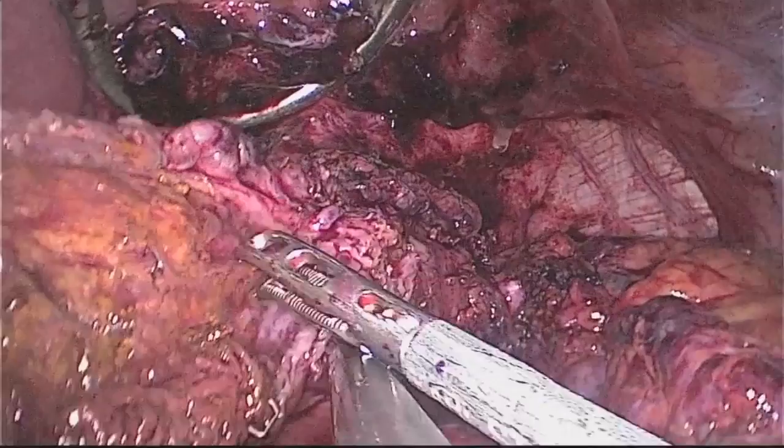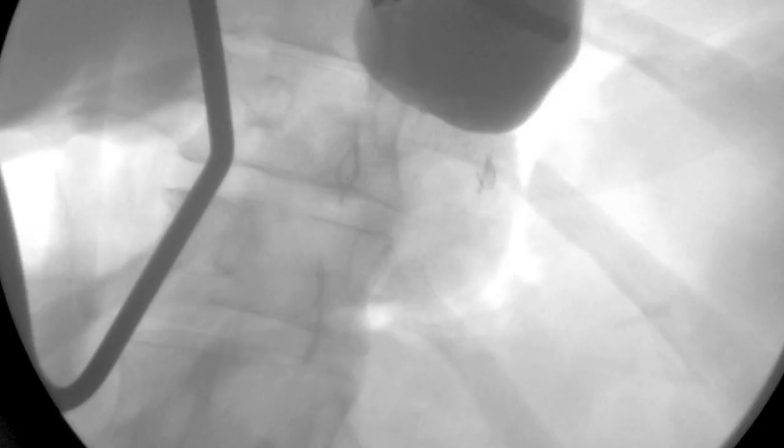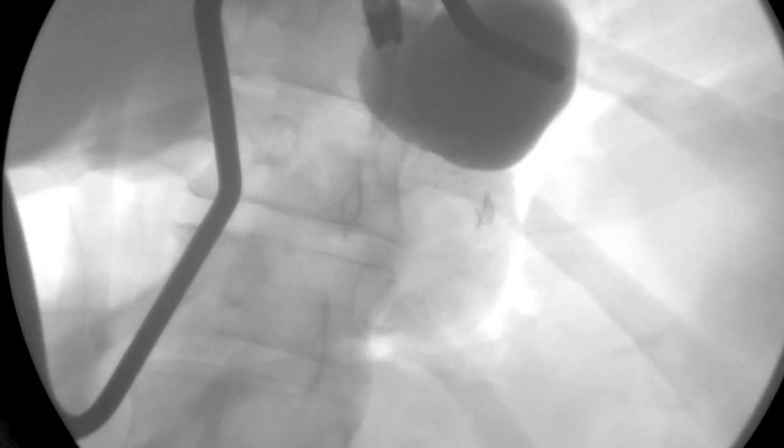Here the sleeve has been completely mobilized. Although not shown, endoscopy was performed with the scope passing easily from the gastroesophageal junction down to the pylorus. Due to his previously failed dilatations, an intraoperative fluoroscopy was performed with the patient in steep reverse Trendelenburg. 10 mm clips demonstrate the area of stenosis without passage of contrast.